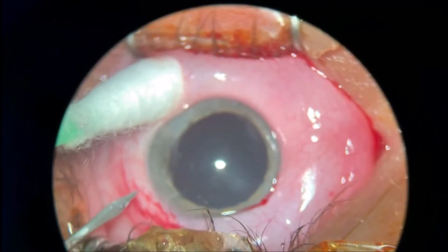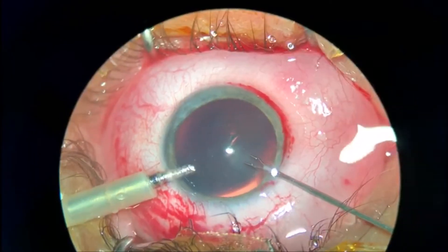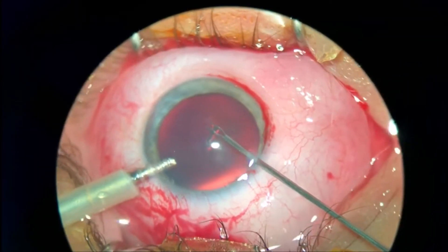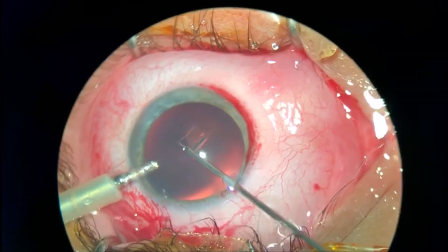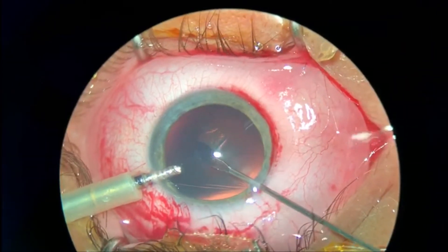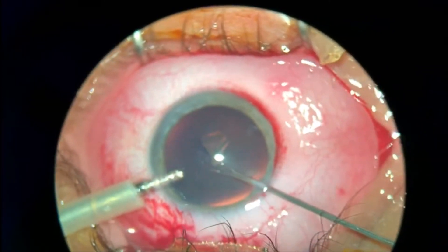Dear colleagues, this is a case of a 25-year-old patient with traumatic cataract, done in subconjunctival anesthesia. As you can see, I did just two side ports.